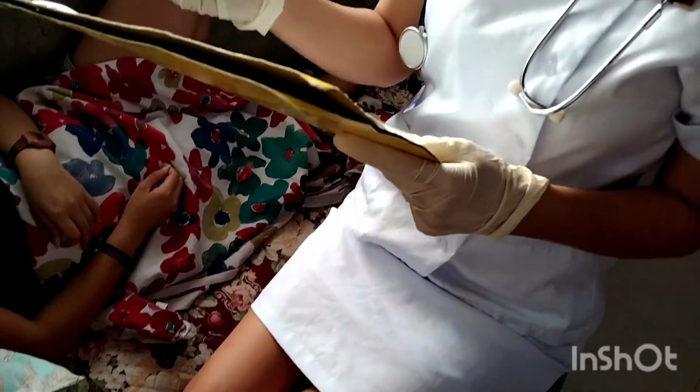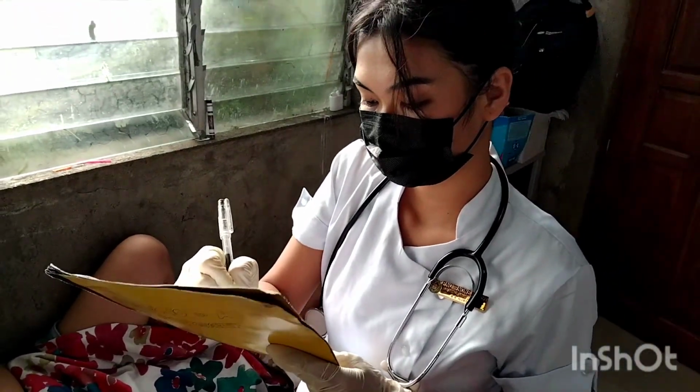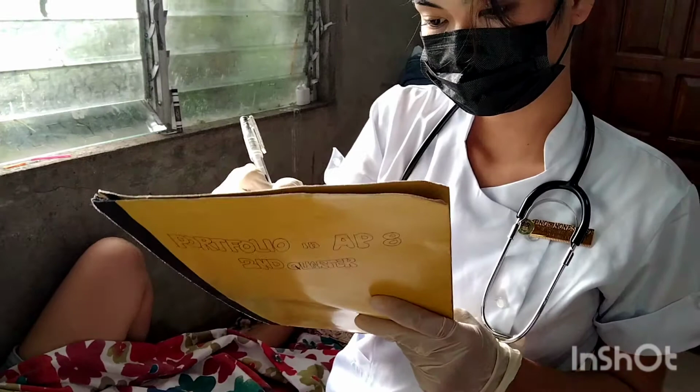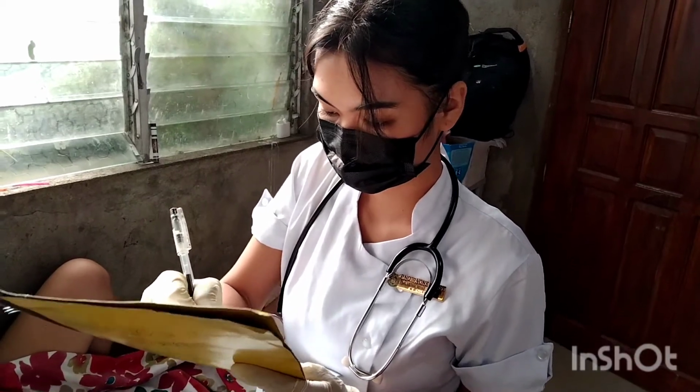Consider the results from pH testing and the aspirate's appearance together. An aspirate with a low pH and a typical gastric fluid color indicates a high probability of gastric placement. In contrast, a golden-colored aspirate with a high pH indicates a high probability of intestinal placement.